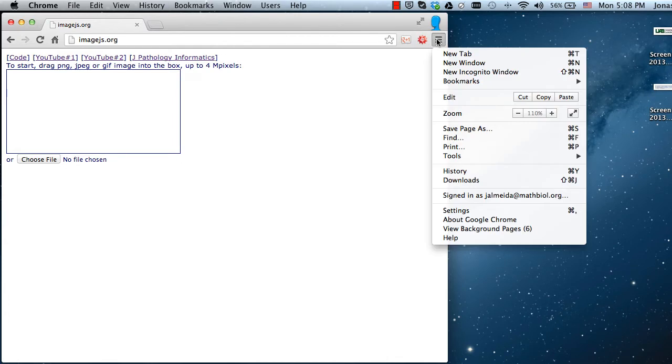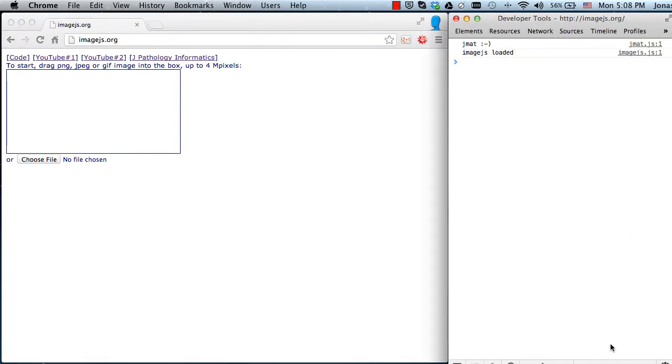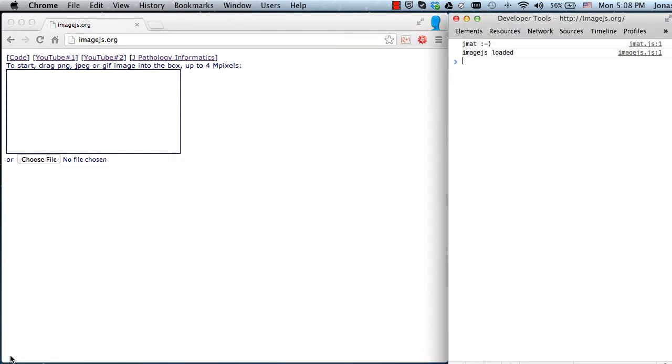So notice that things can go wrong with imagejs, and the best way to make sure there is nothing bad going on is to open the JavaScript console. You can open it as its own window, or you're probably more used to seeing it down here. You can toggle between having it within the window or to the side of the window or wherever you think it looks better. So the first thing you notice is that the console is telling that the two libraries, imagejs and jmat, were loaded.